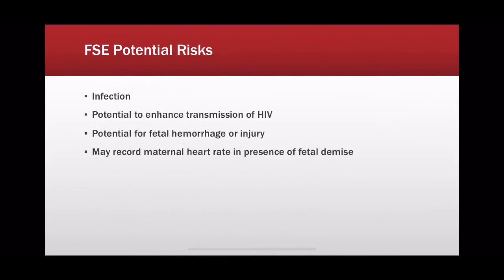Some of the potential risks include infection, the maternal and neonatal infection. There is a potential to enhance the transmission of HIV. There's a potential for fetal hemorrhage or injury, and this may record a maternal heart rate in the presence of a fetal demise.